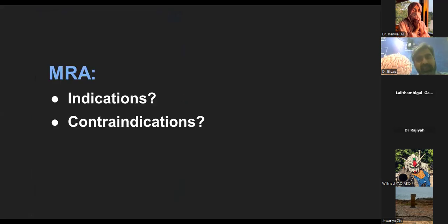So the second is the MRA. What are the MRA indications? Anyone? I think the MRA indication would be when we are not able to assess an aneurysm. If the DSA or the CTA is negative, and we want to further assess once the clot has resolved, then there is value for an MRA, or to see if there are any other vessel abnormalities that we'd like to assess.